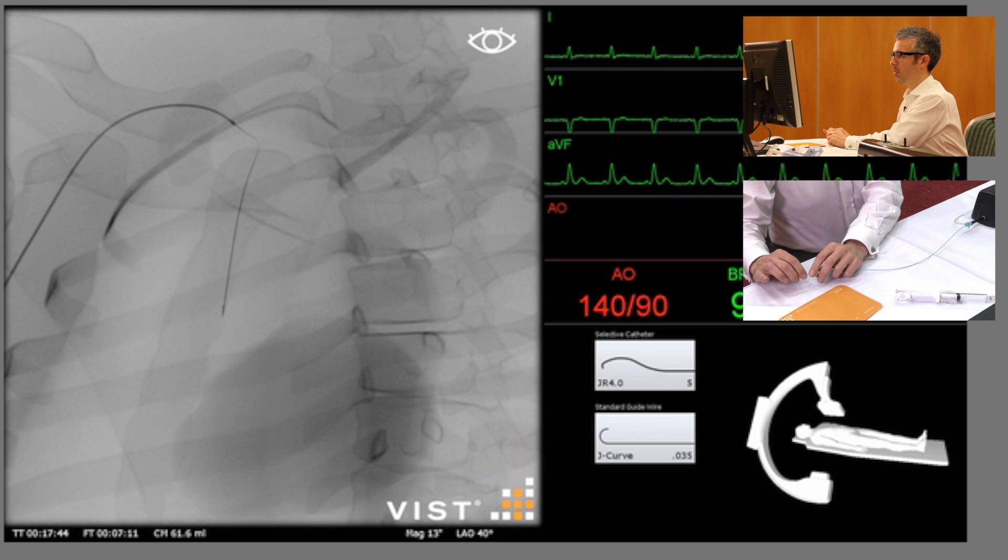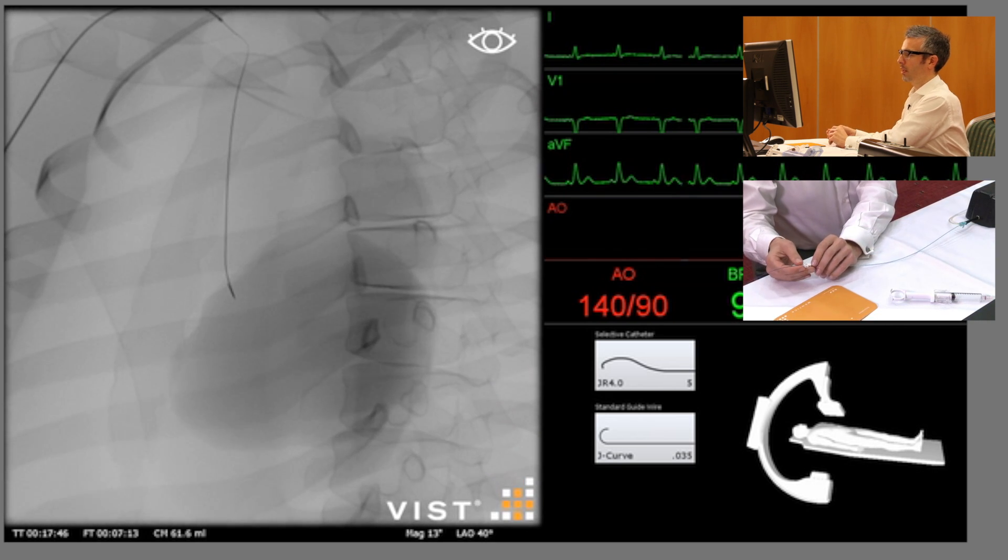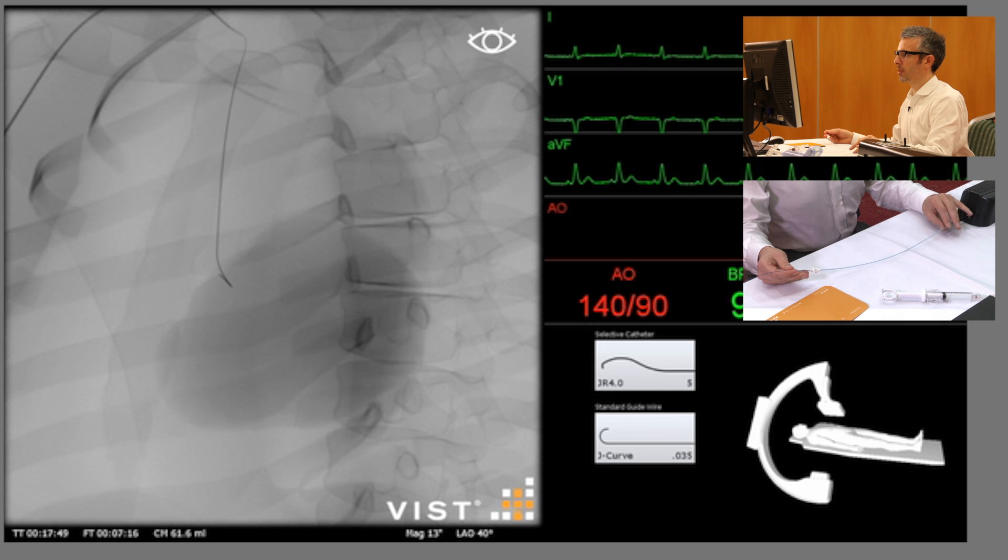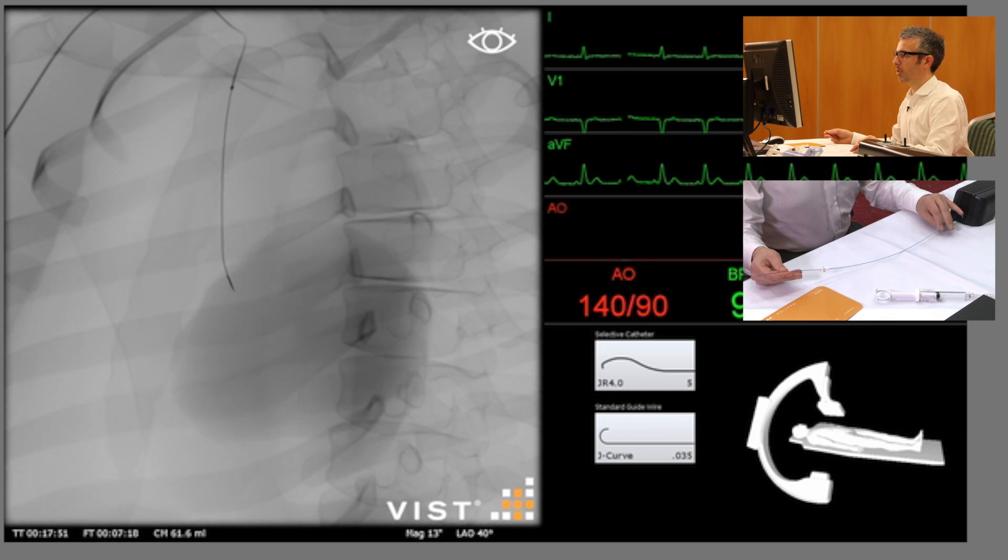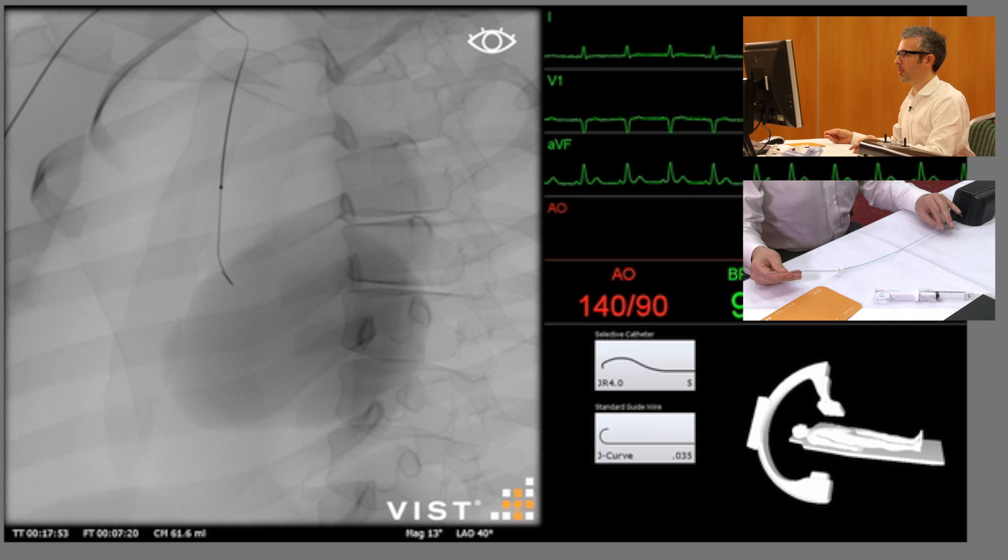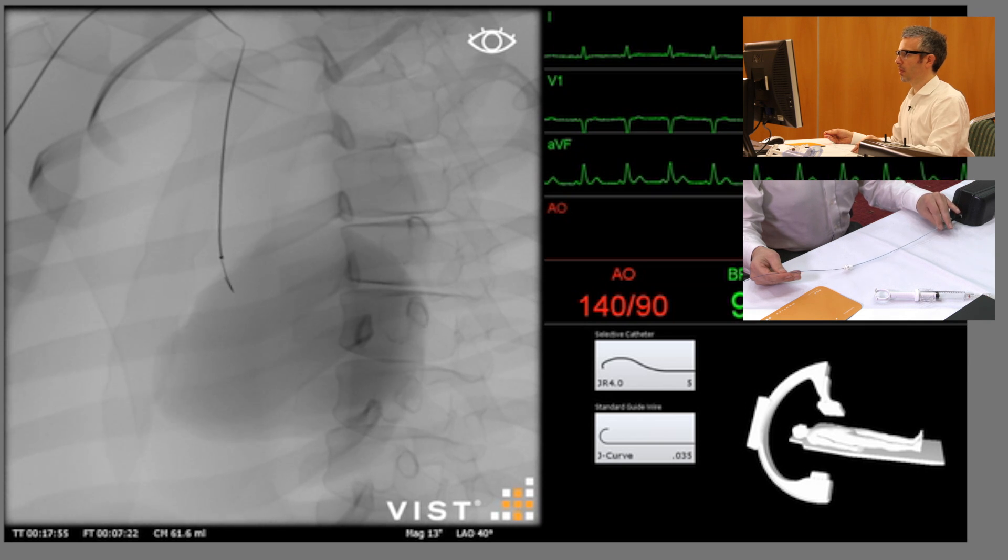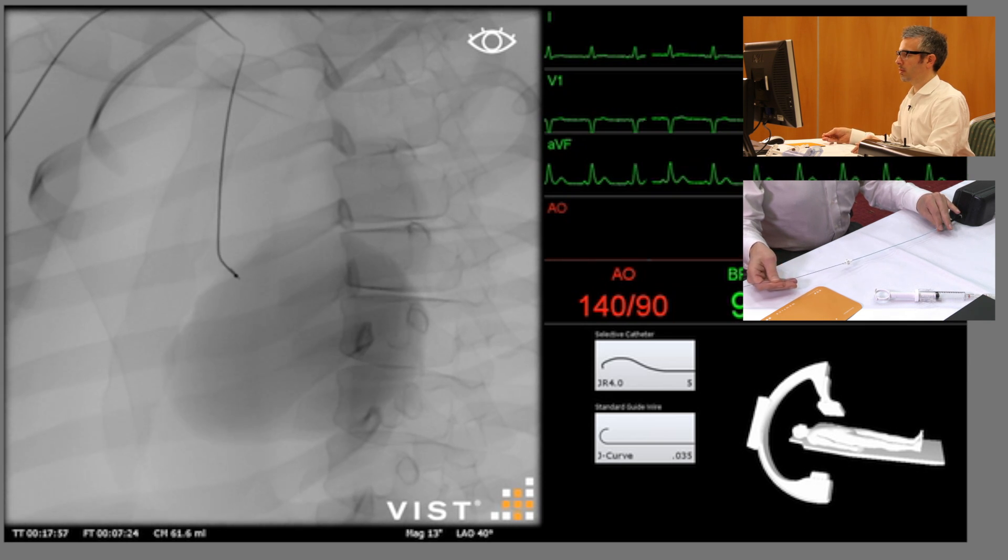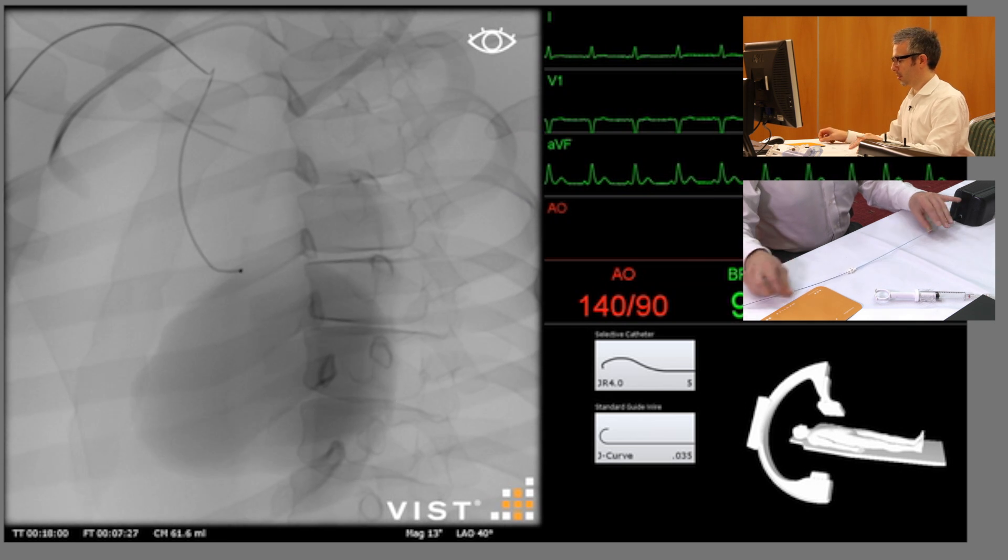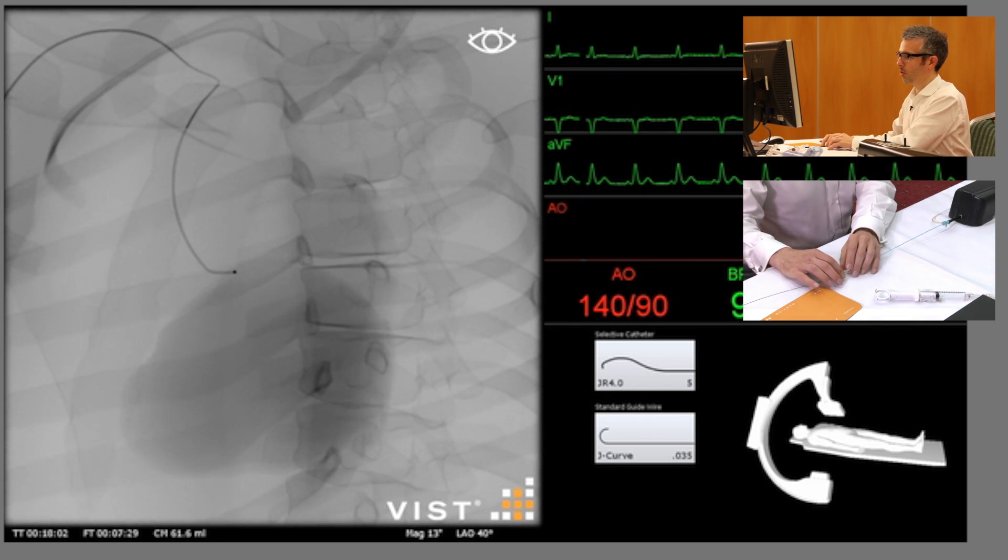And now you can see the wire heading down into the ascending aorta catheter on the left-hand side of the screen. I'm bringing down my guide catheter now whilst keeping the wire fixed. And that's the job of the 035 guide wire completed. I'm just going to leave that at the top here.